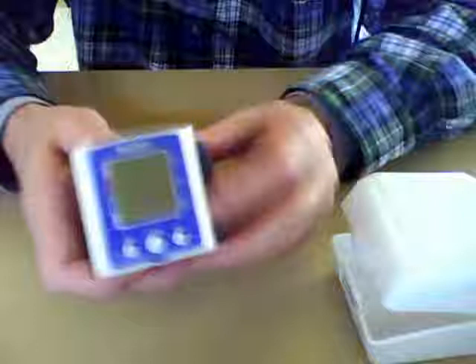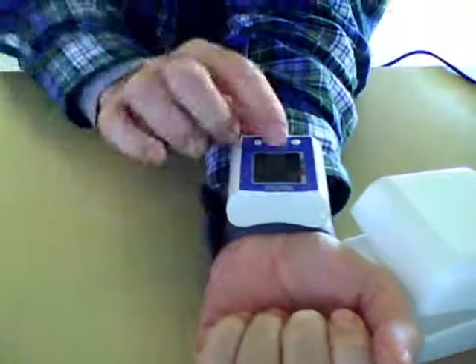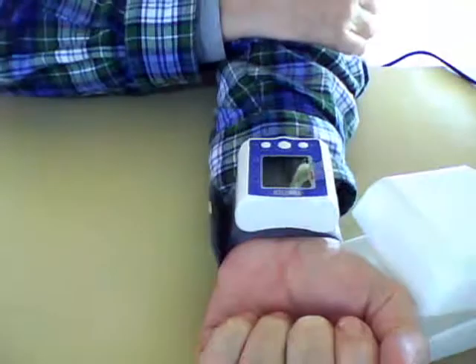The first device we have is a portable blood pressure meter. This little device goes right on your wrist. You get a real fast check of your blood pressure and your pulse. Just put it on like that. Push the button and wait for the reading.